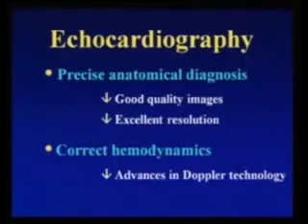We all know echocardiography is one of the main arms of the stool if we think from the examination of a child with congenital heart disease. It is clinical examination including history and physical, then X-ray, ECG, and now it is the echocardiography. Why echocardiography is important and how we should go for the echocardiography, we are going to discuss in this session.